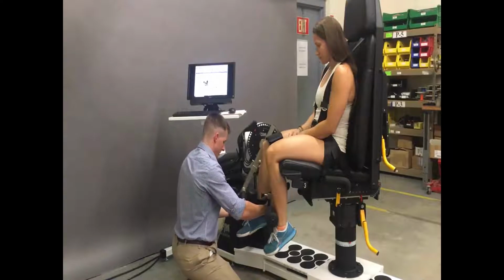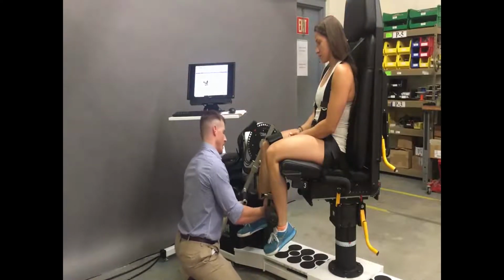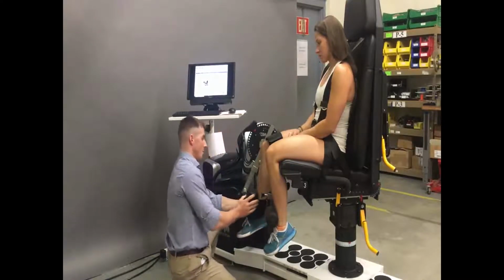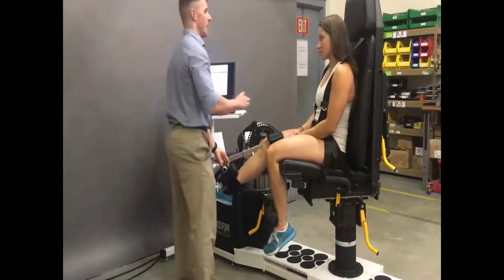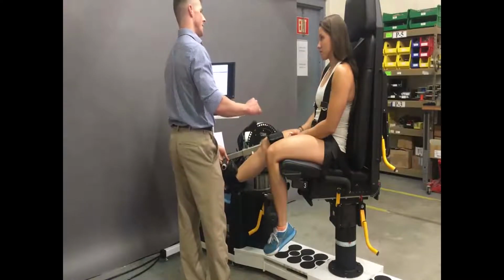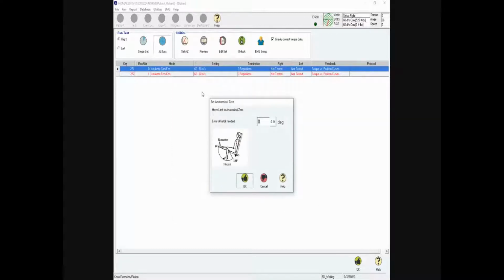And here's a side note on being warm, right? So if I'm testing an athlete for return to play, I want to make sure they're not just warmed up, but sometimes I want to fatigue them out completely. That way I see how they perform in that fatigue state. So keep that in mind. If this is a return to play test versus just a progress note test or a baseline test, you want to make sure that they're in that fatigue state.